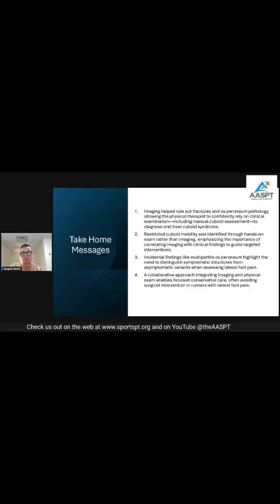A question that was asked regarding this case was, what injury history and presenting signs and symptoms may prompt a physical therapist to seek radiographs to assess for either potential fracture or migration or movement of the os peroneum? I think circling back to the Ottawa ankle and foot rules, positive findings on that, pain in the midfoot region and an inability to weight bear are really local to that region where the cuboid may have extra accessory bone growth.